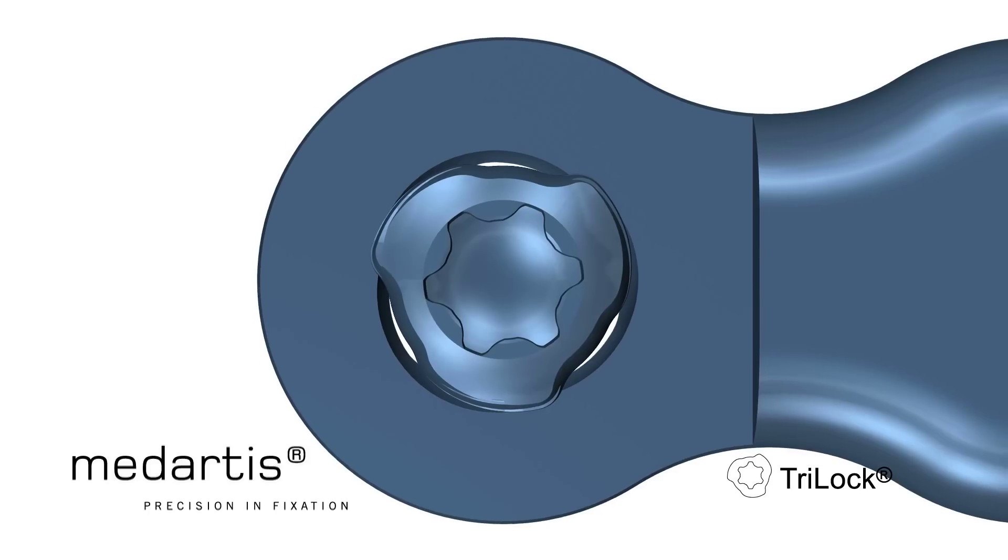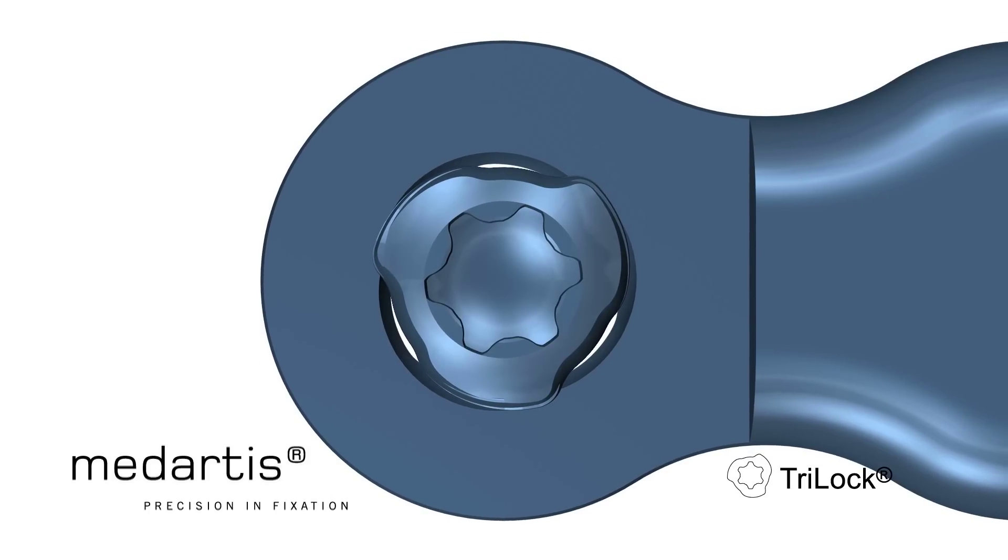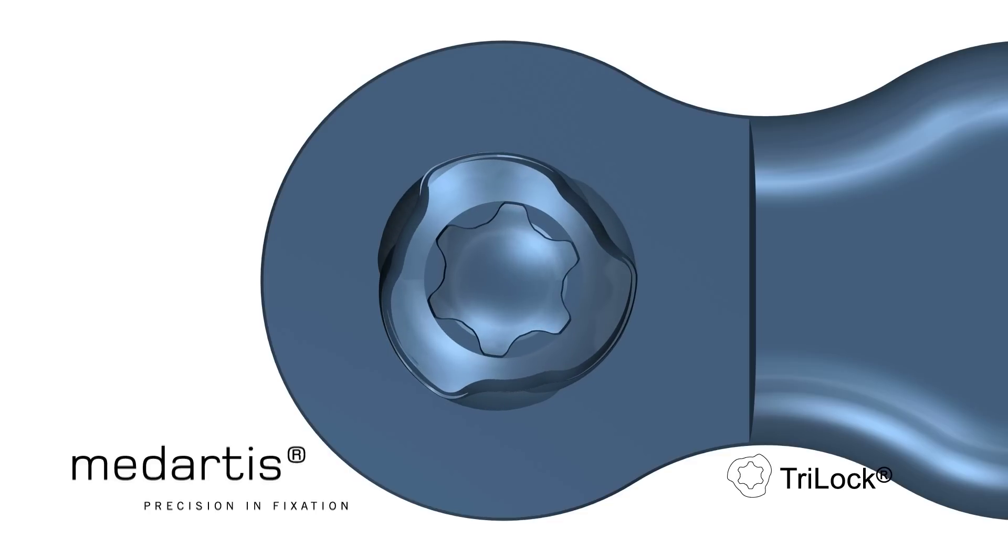In the unlocked state, there is a tiny gap between the screw head contour and the plate hole. This gap is gradually closed during the locking process. Once the contours meet, contact zones are created that grow bigger while an increasing torque is applied.